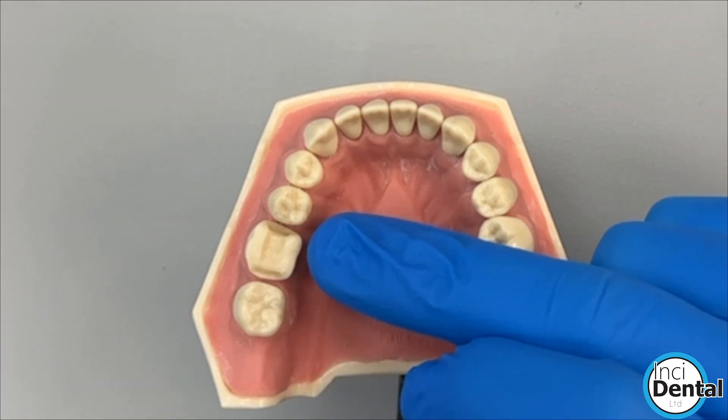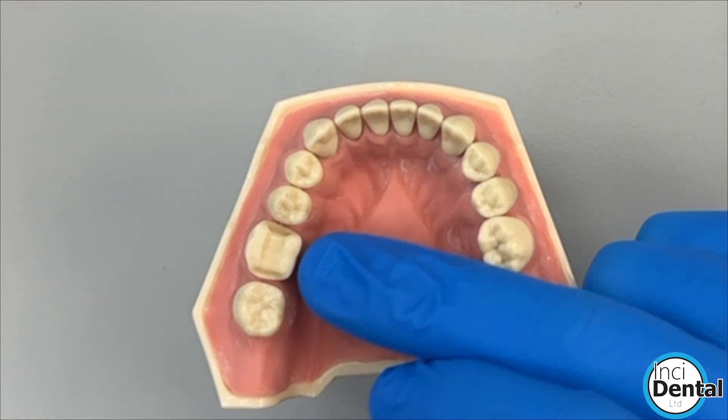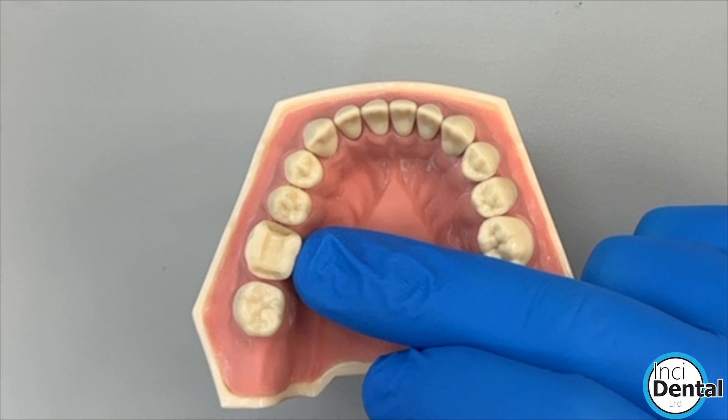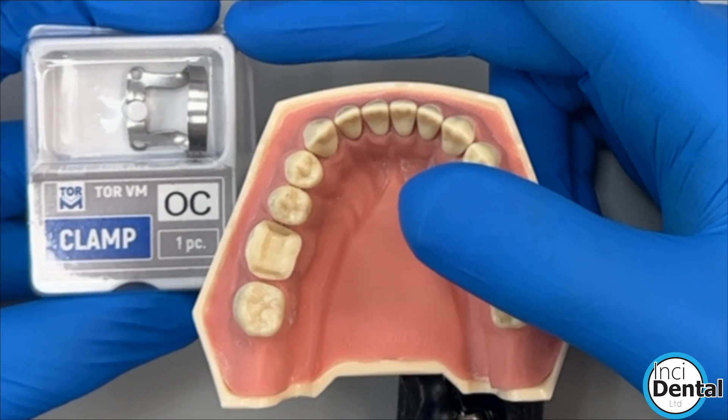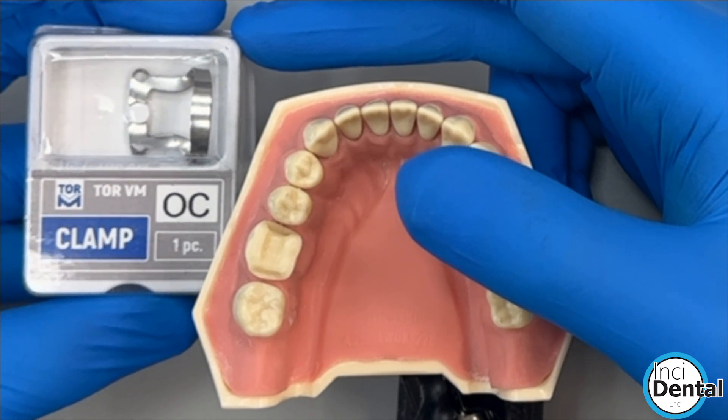In this video I'm going to show you how I like to isolate a tooth for an adhesive overlay and cementation appointment. We're going to be showcasing the brand new OC clamp which we developed with Torviem over the last year or so.